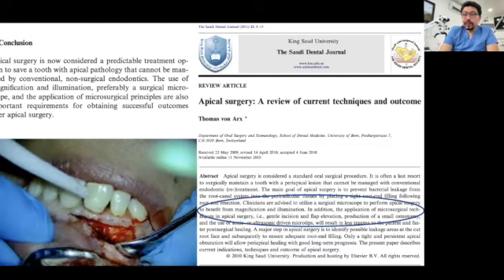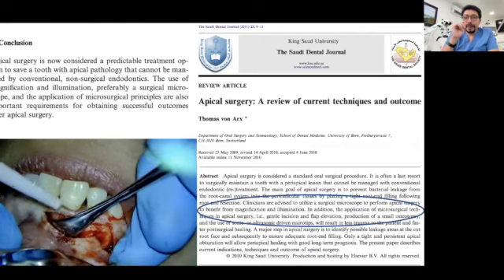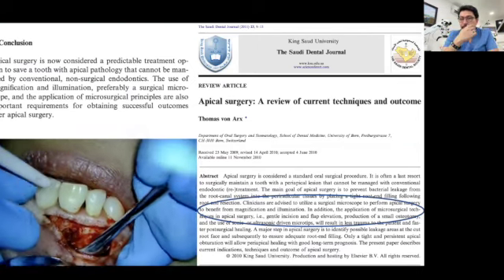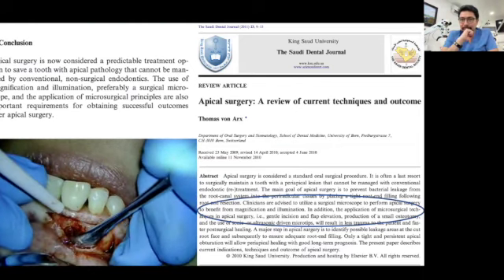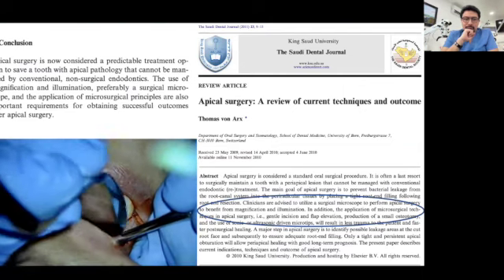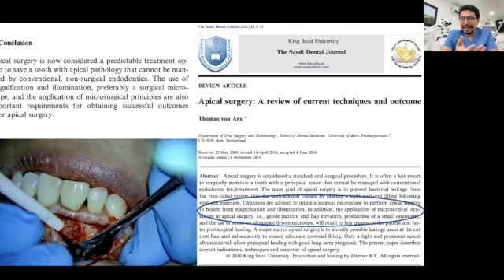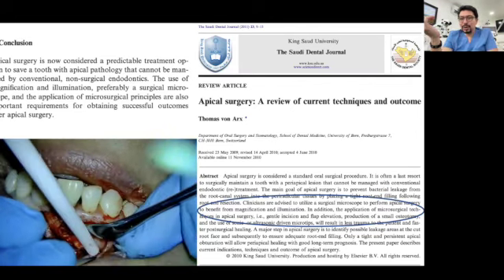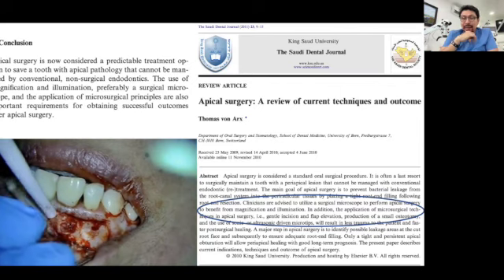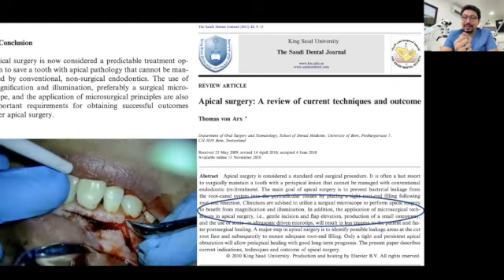So as you notice, we were able to perform a very precise treatment, but the focusing, the depth of field will reduce as well. As you know, we have many new devices in the market related to digital dentistry, but all this technology, when we analyze the success rates before any new technology and what we used to do, most of the time you will notice that the success rate is the same.